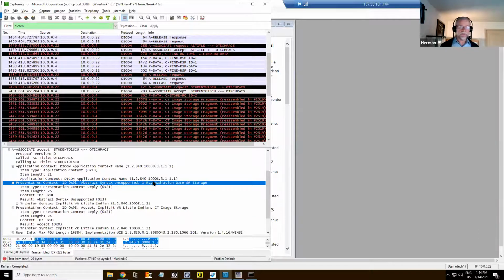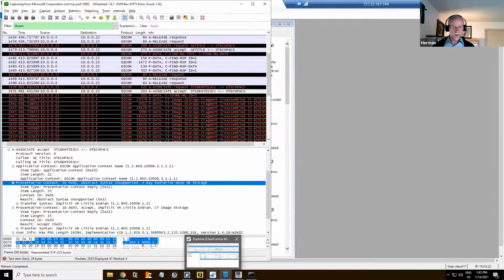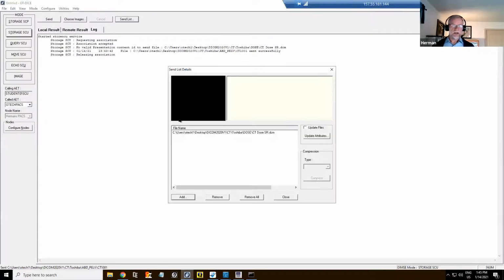but I do not accept the presentation context for my structured report because it says abstract syntax unsupported. Remember when I said what you're always looking for at the accept for the association is if there are any errors. And indeed it says abstract syntax not supported. I'm not going to accept it, right? If we go back to, for example, my simulator, we'll see in the queue, this is still in the queue. So that didn't make it. Right? So that's a typical error when we try to send something that is not accepted.